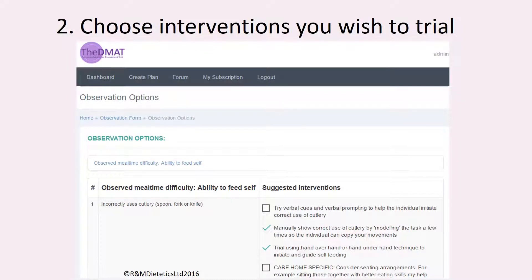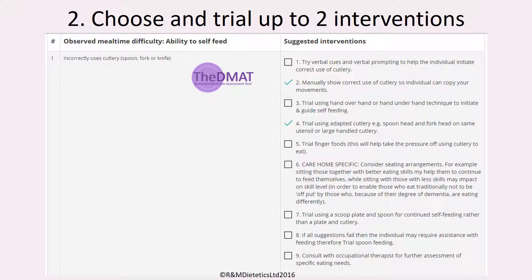The software will now present you with the eating difficulty you identified and a list of potential interventions for you to try. Once again, you simply tick the box of the intervention you wish to try. Different eating difficulties will have different amounts of interventions available to choose from. In the example here, the eating difficulty identified was incorrectly uses cutlery and there are nine interventions to choose from.